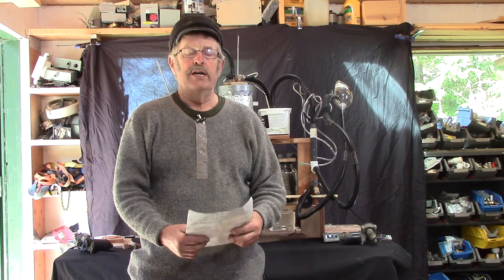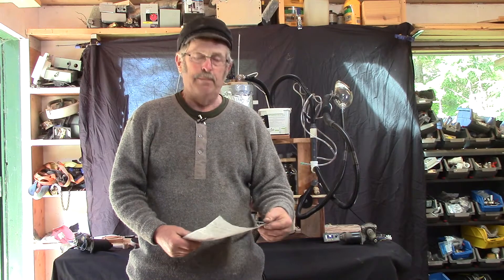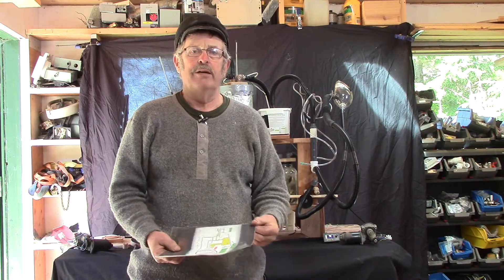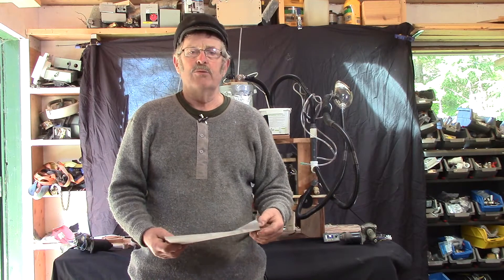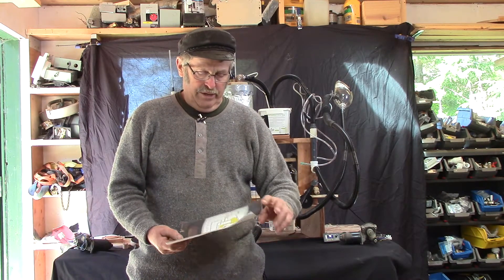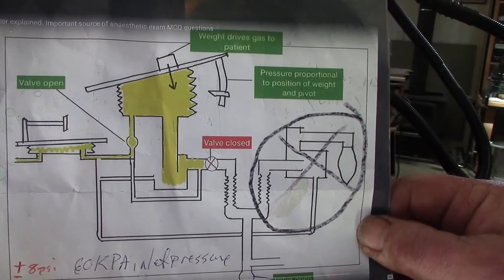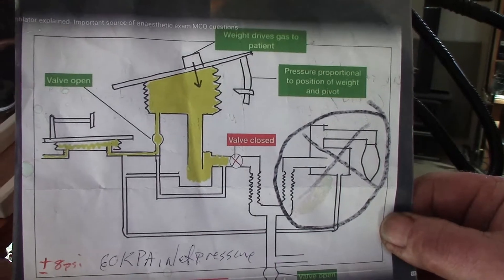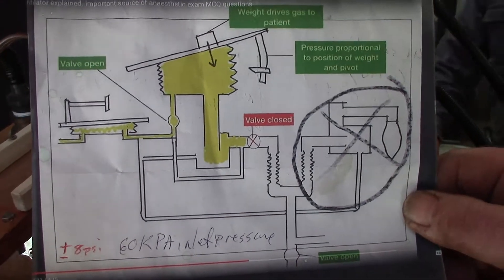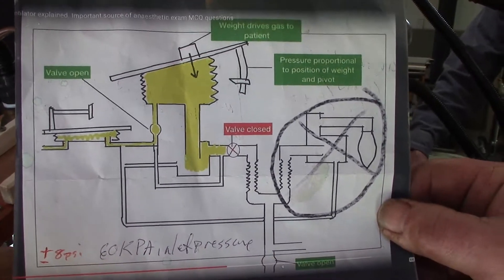So I spent about six hours online and I came across a great tutorial out of England on a Manley MP3, patented 1961. No electricity on it whatsoever. Here's a rough schematic. This Manley MP3 ran straight pneumatically and it was known for its reliability. It ran on 60 kilopascals inlet pressure, or about eight PSI.